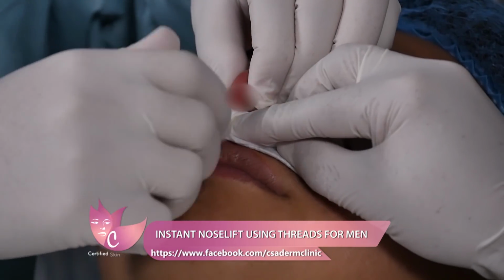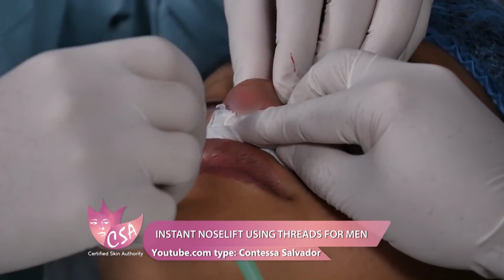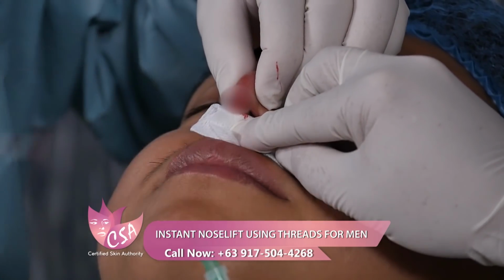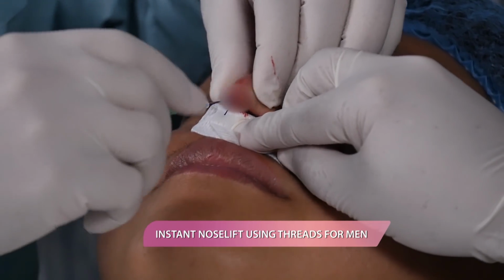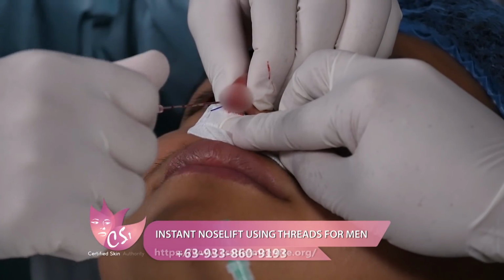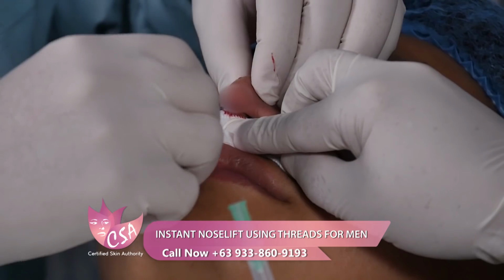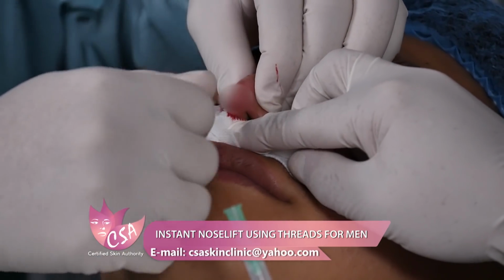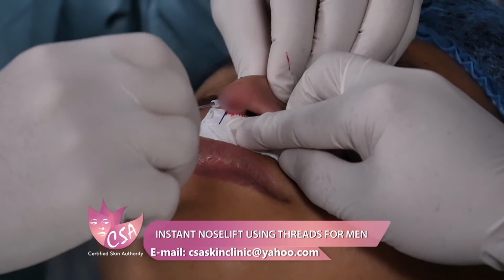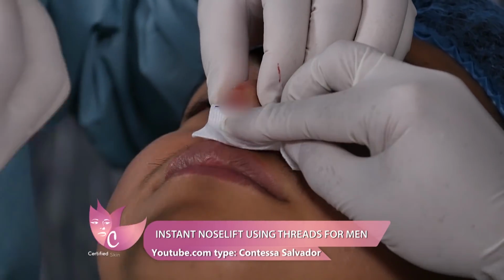So depending on the length of the nose of our patient, we also follow that length and we use the type of thread with the kind of length that will fit in the nasal bridge. So sometimes we have patients with shorter nose and the length of the thread exceeds, so that's fine. You just need to cut the excess thread in the opening. So again, we have variable lengths of the threads. Even the cannula, ideally the cannula is 60 millimeter, and then with our length of the thread, it could be 70 millimeter, 80 millimeter, or 90 millimeter.